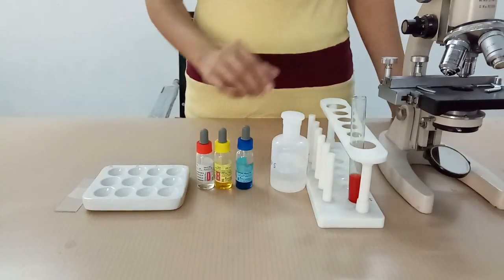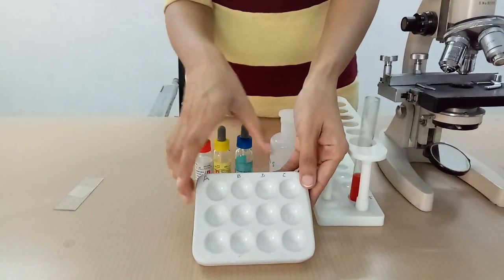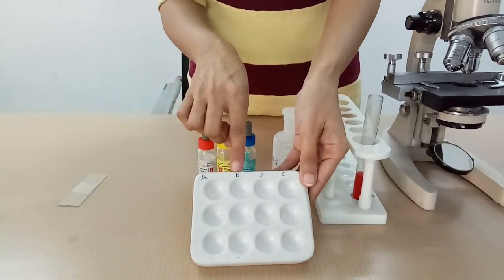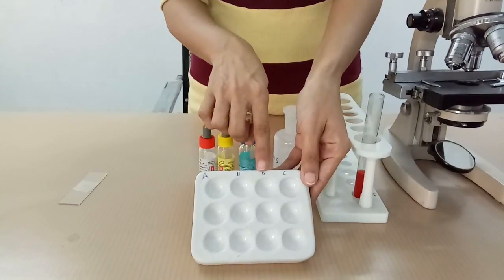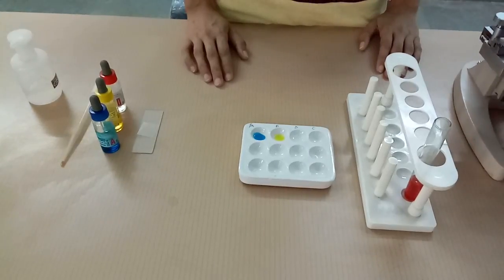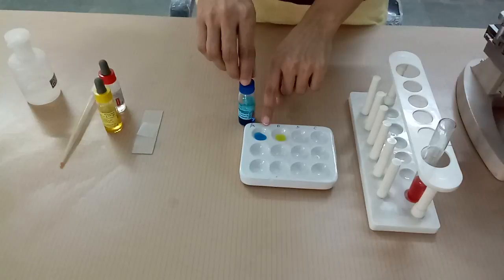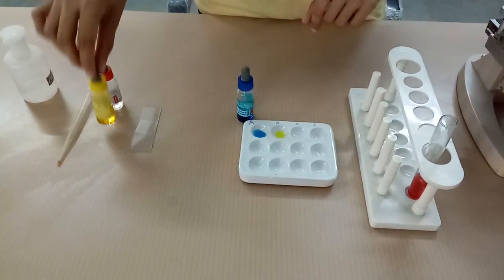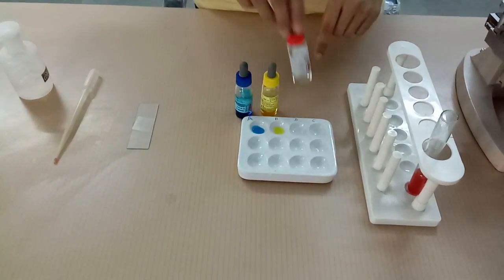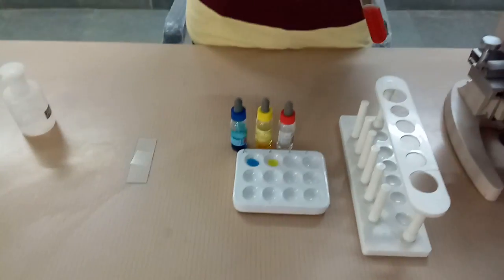Now take porcelain tile and label it with anti-A as A, anti-B as B, anti-D as D, and control as C. Place few drops of sera accordingly. Anti-A in the tile pit written A, anti-B in B, anti-D in D, and red cell suspension in control.